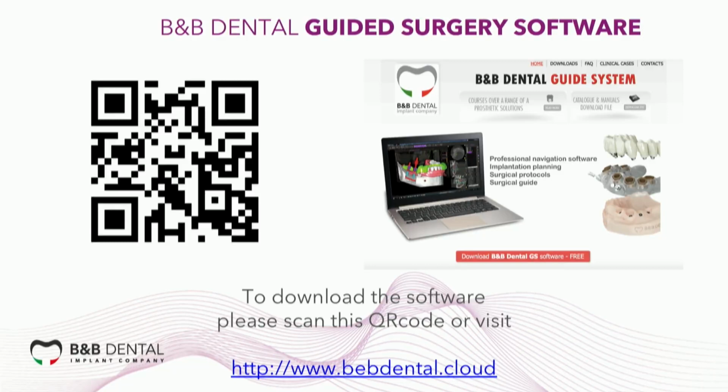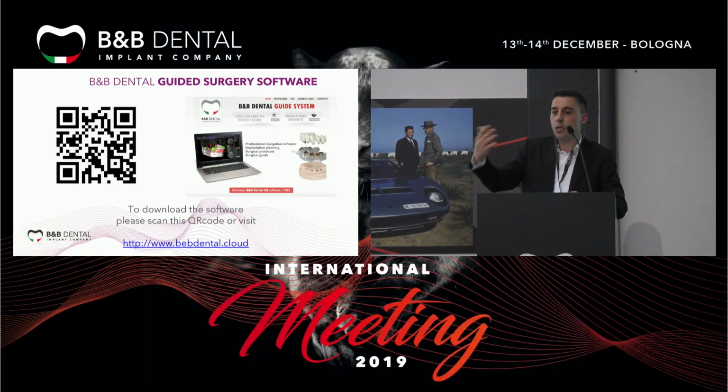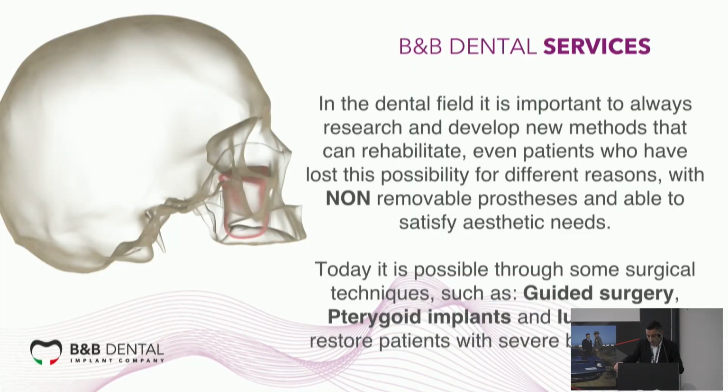Our software is completely free. You can download it, you can use it. You have to pay just when you export, after your implant planning, after designing your surgical guide. After that, you can export the STL file, and then you have to pay a little bit to export that file. My presentation about the software is over.